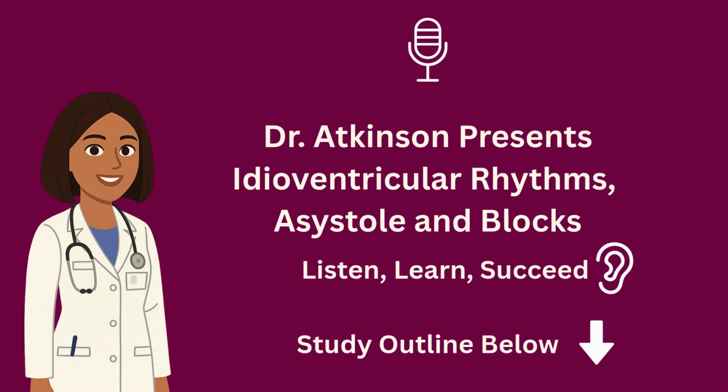Asystole is even more dire. It's the complete absence of ventricular activity, seen as a flat line on the ECG. There's no pulse, no cardiac output, and without immediate CPR and advanced life support, death is inevitable.